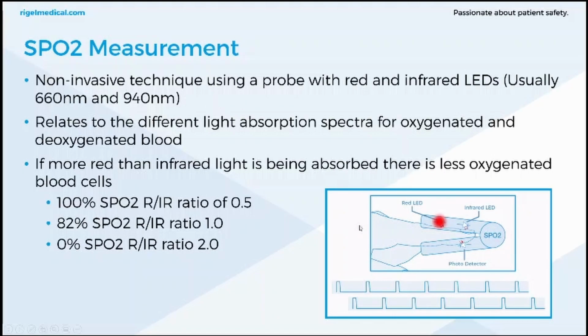Now, a pulse oximeter can determine oxygen concentration by measuring the difference between red and infrared light being absorbed by arterial blood. So to do so, you use a finger probe, such as shown here, or an ear probe, but most commonly using a finger. And then a red and infrared spectrum LED is driven by the monitor. And this is done at consecutive intervals, as shown on this diagram. Typically, I think about 5 kilohertz, and this is shown in this image at a much slower rate.